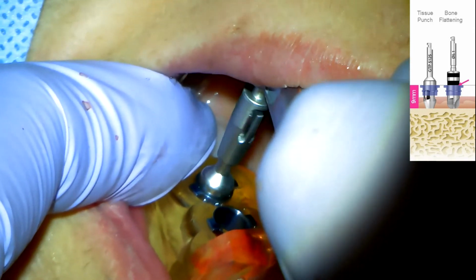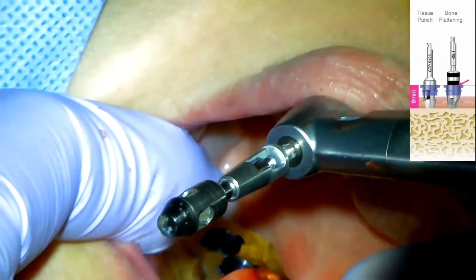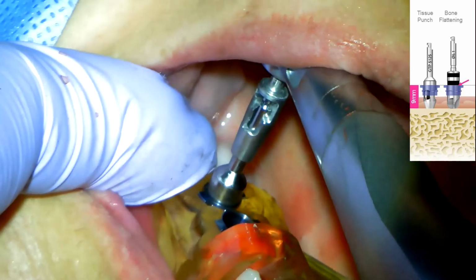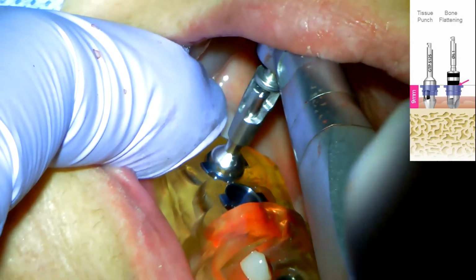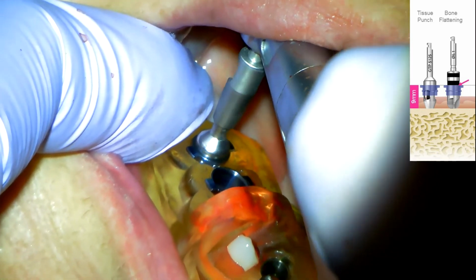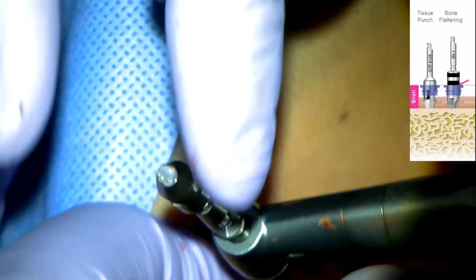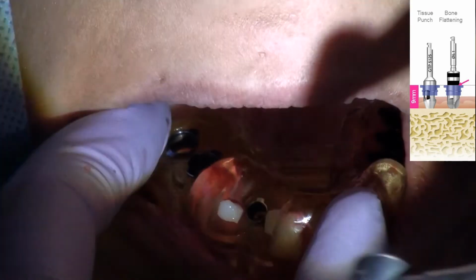Push hard, little wiggle, push hard. Got some of it, not all of it. And there it is again. So both are tissue punched. No reason to take the guide off.